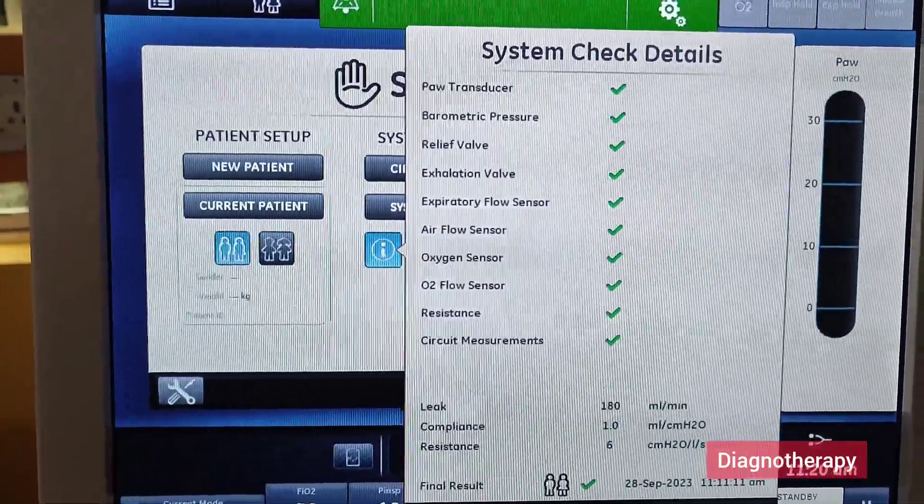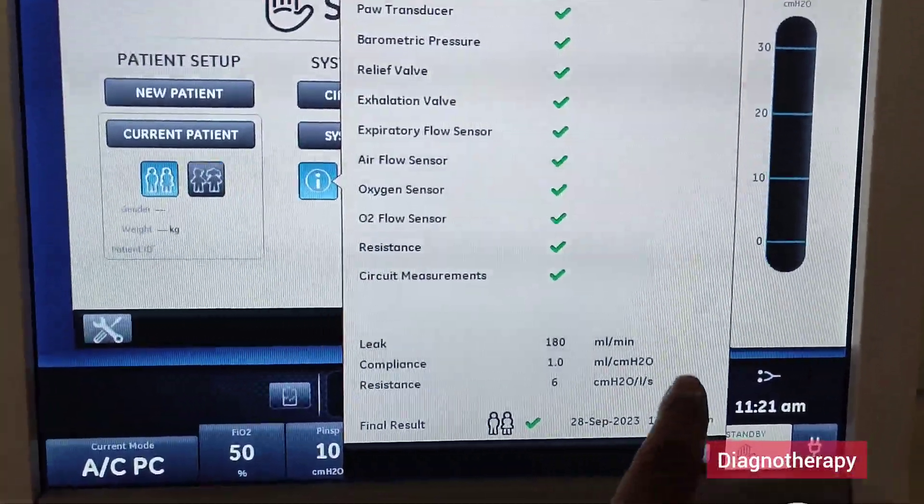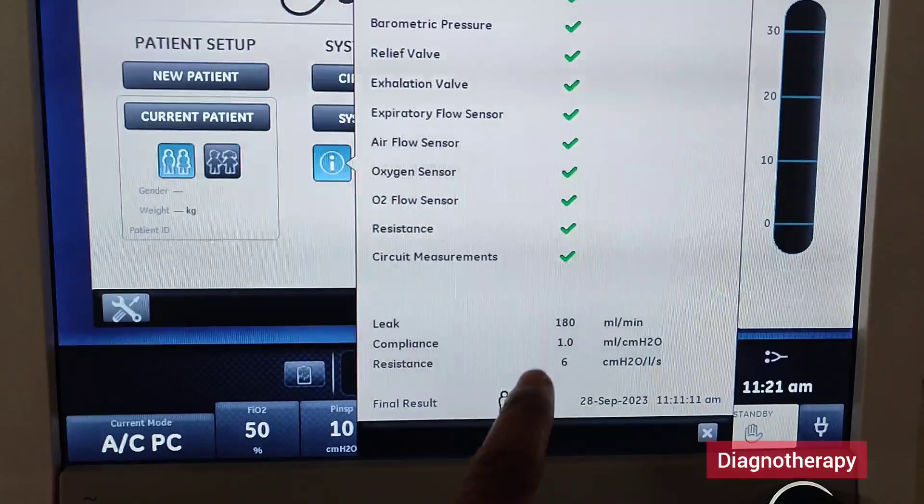The system check details are basically a self-testing method. In this, all the parameters will be tested, and also the leak, compliance, and resistance of the circuit will also be checked in this test.